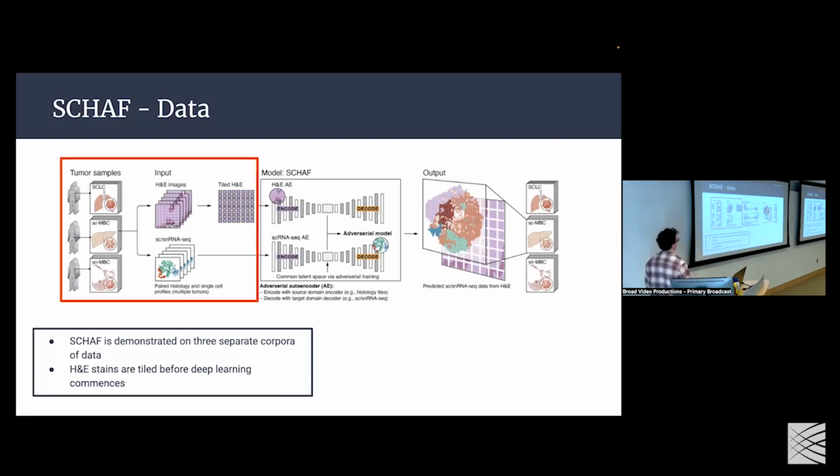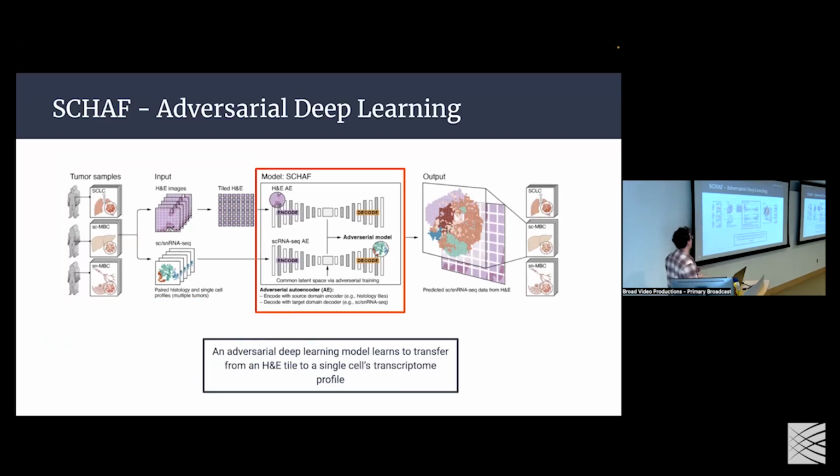So what we're going to do is actually just tile our H&E images. It's a very popular technique. A lot of other histopathology type analysis papers usually start with this, but we're just going to slide a window across our histology stains and tile them so that each tile will more or less represent, in theory, a cell in its surrounding neighborhood. And going forward, what we now have is, for a corpus, a lot of tiled H&E images and a lot of single cell RNA sequencing data.